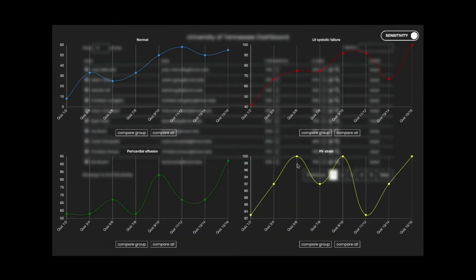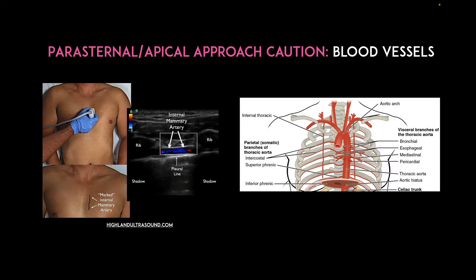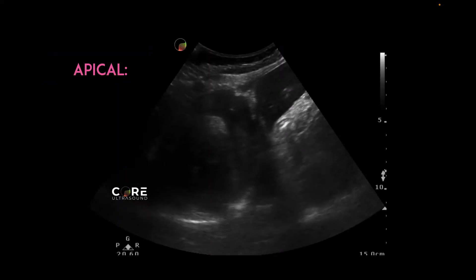When you go peristernal or apical, just be careful with blood vessels. There is an internal thoracic — also known as the internal mammary artery — in the peristernal location that you should be careful of, and then of course you have your intercostal arteries that usually sit below the ribs themselves. If you want help making sure that you miss them, put Color Flow Doppler in the region where you're going to do the procedure before you do it, to make sure that you don't have any big blood vessels there.